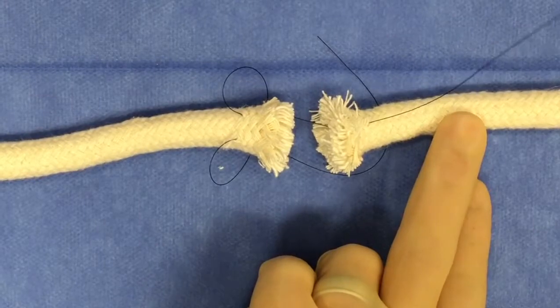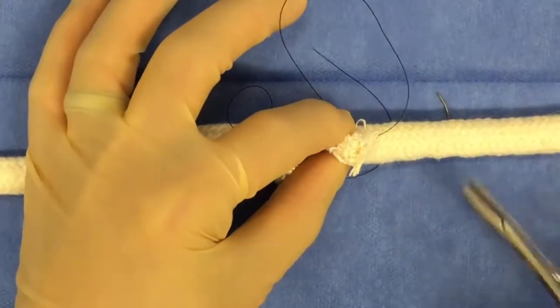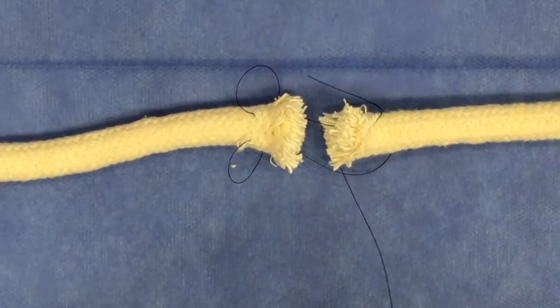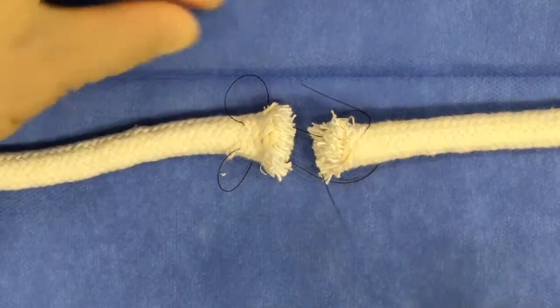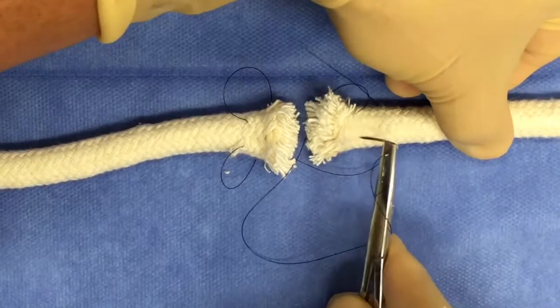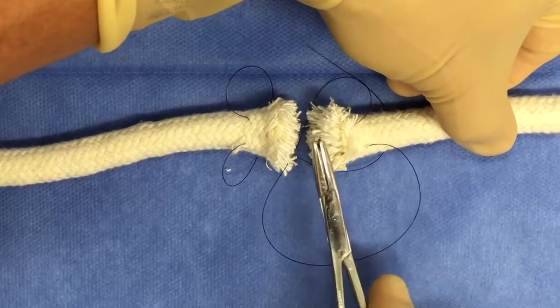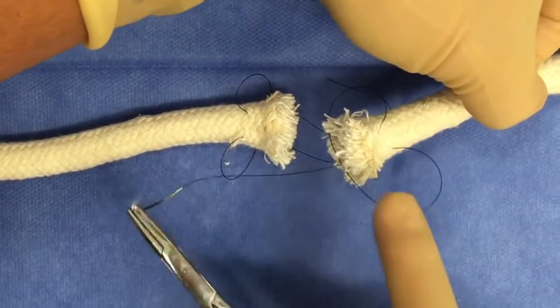Your suture is going to exit through the dorsal aspect of the tendon, and you're again going to loop your suture behind the tendon, so ventrally to the tendon surface when you're dealing with an extensor tendon. You'll then take your suture and you will enter again through the dorsal surface of the tendon, and your suture will again exit through the cut end of the tendon, such that you develop this butterfly type pattern with your suture, which will cinch down once you tie the knot.